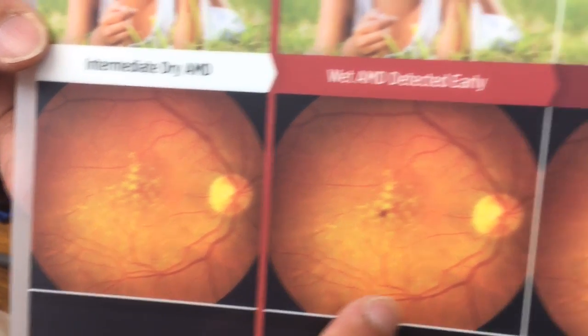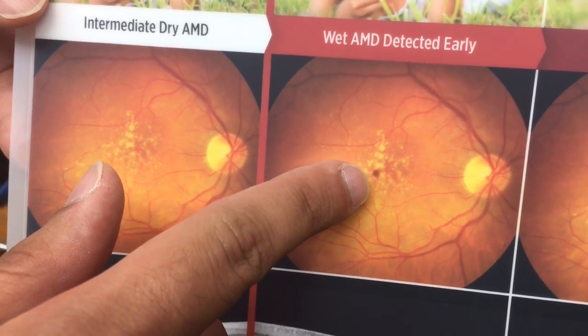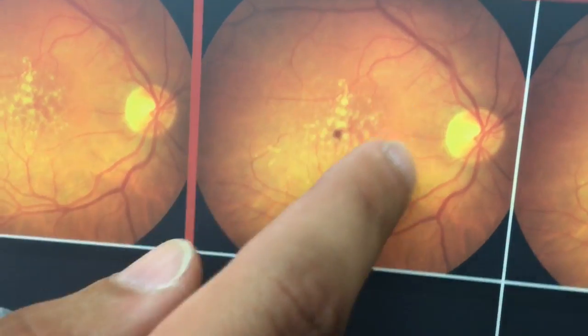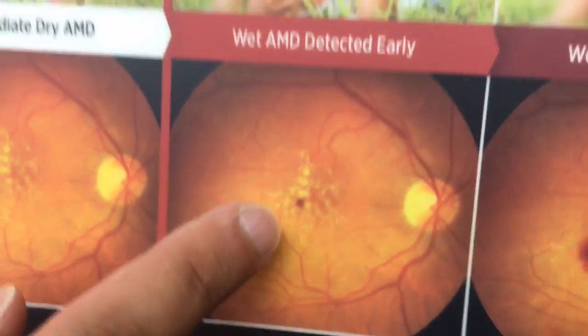This second picture is showing very early changes from the wet form, which you can actually see right in the center of the retina. There's a little bit of a blood spot there. This is the nerve of the eye, the blood vessels here. This is the center of the vision, most important for seeing. You can see a small little blood spot here. This is very early changes.